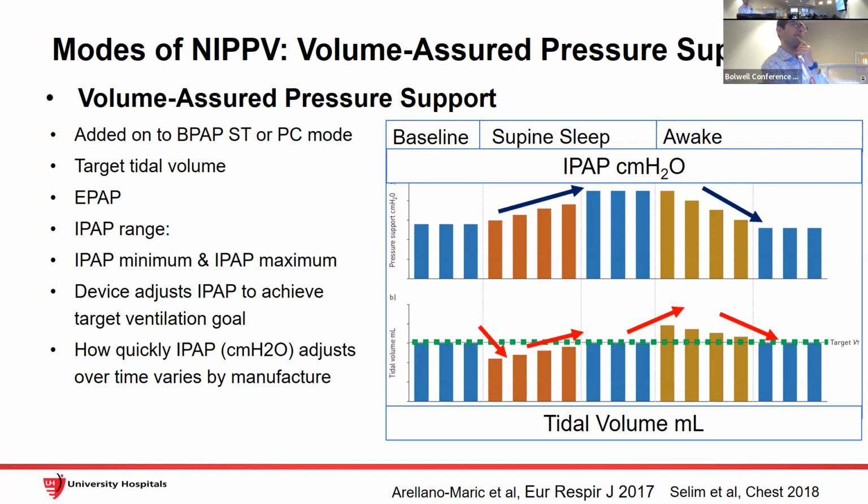Great. So Sushil, is there anything in his previous talk that you want to go back and emphasize? I have a few things. Moshe's, yeah, there were a couple of slides there. I think this is like 101, which is perfect. I had a couple of questions that are probably 201 level, about Respironics versus ResMed. It's probably worth pointing out that they approach this very differently in terms of how to adjust cycle and threshold sensitivity.